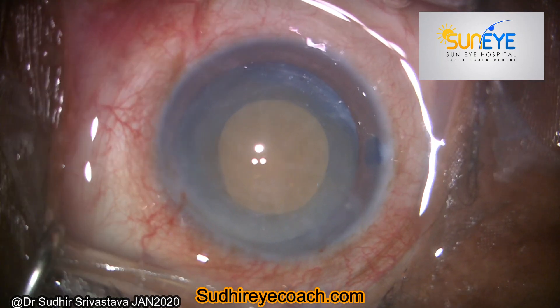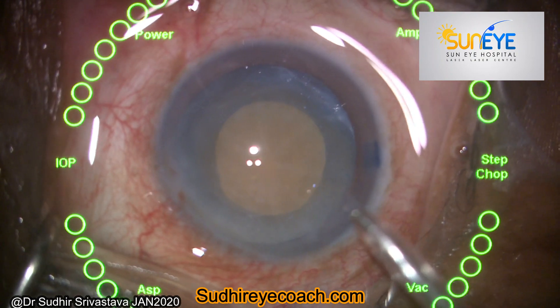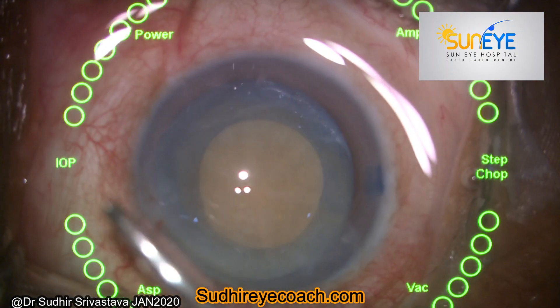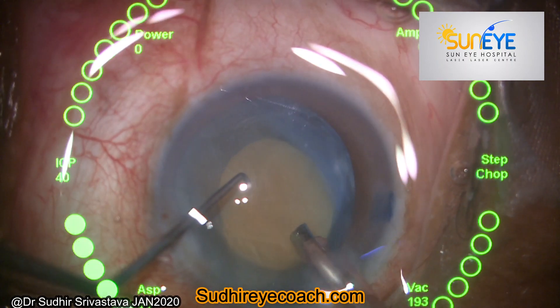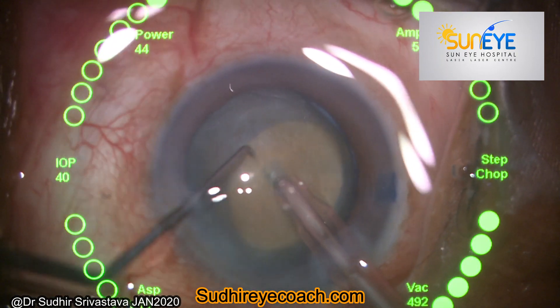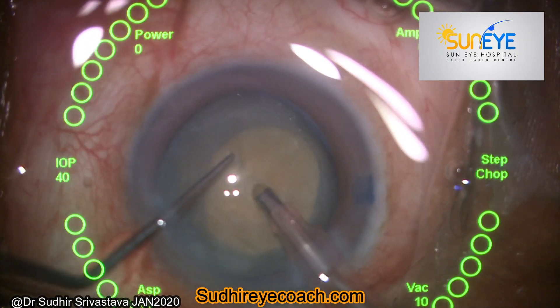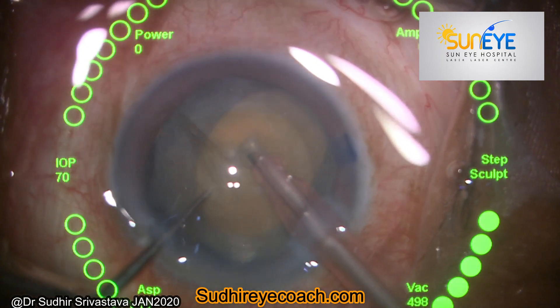Performing phaco and nucleus segmentation is a challenge in such cases because the nucleus starts rotating freely and it is very difficult to hold it. Here I always try to catch the nucleus with the phaco tip while my second instrument, the Sinsky hook, supports the nucleus and prevents rotation.